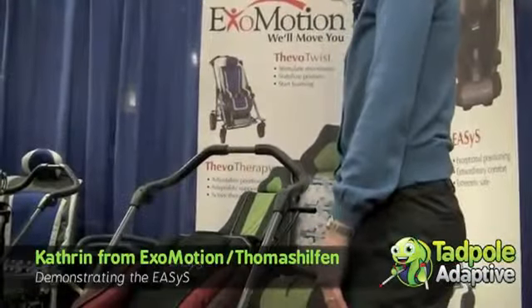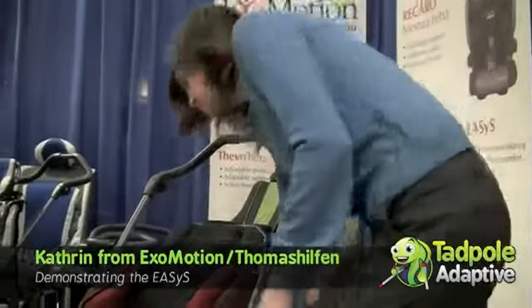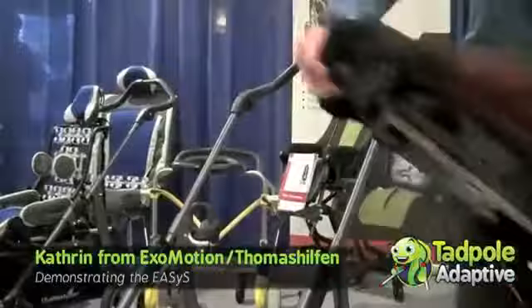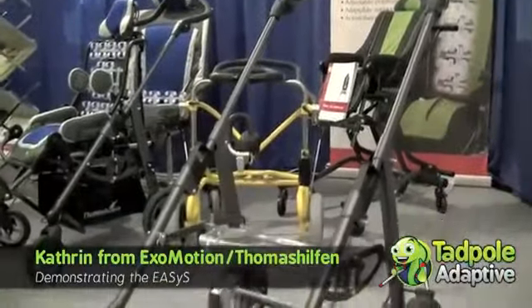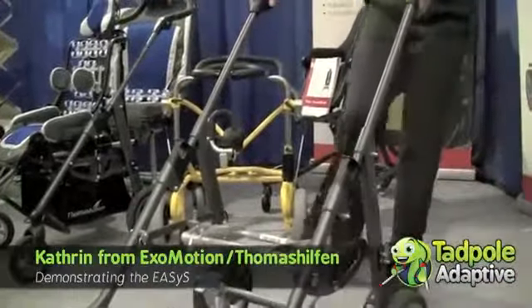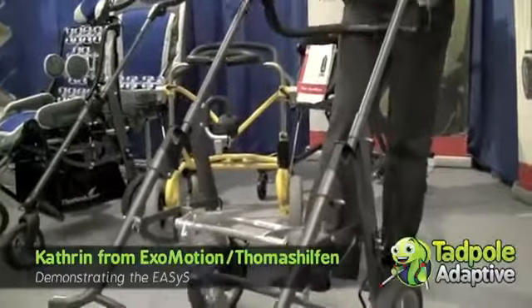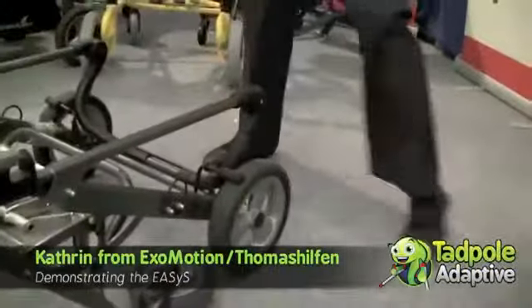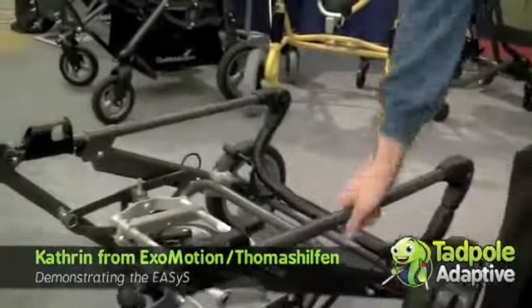It's very easy to fold the Eases. Take off the seat first and then just very simply, like a regular stroller, fold it, and with that you can easily put it in your car.